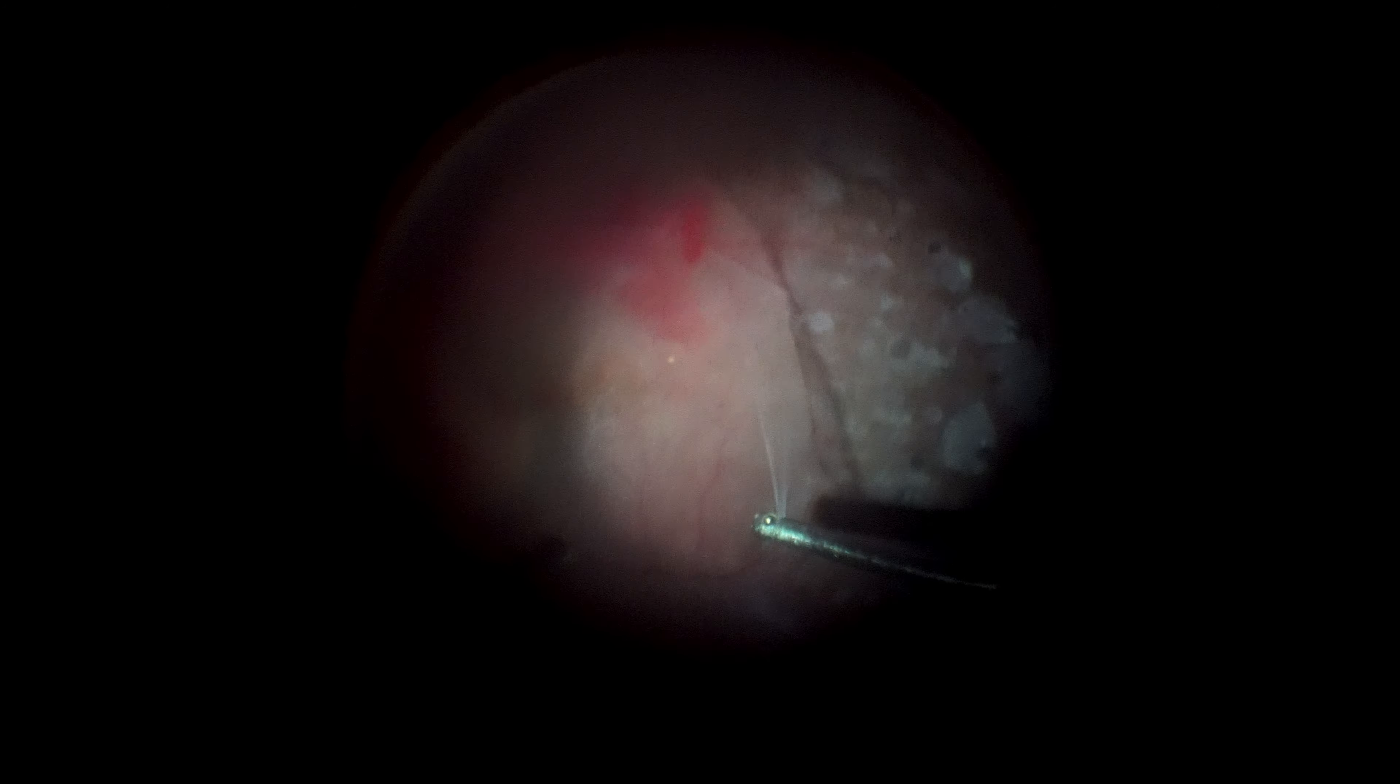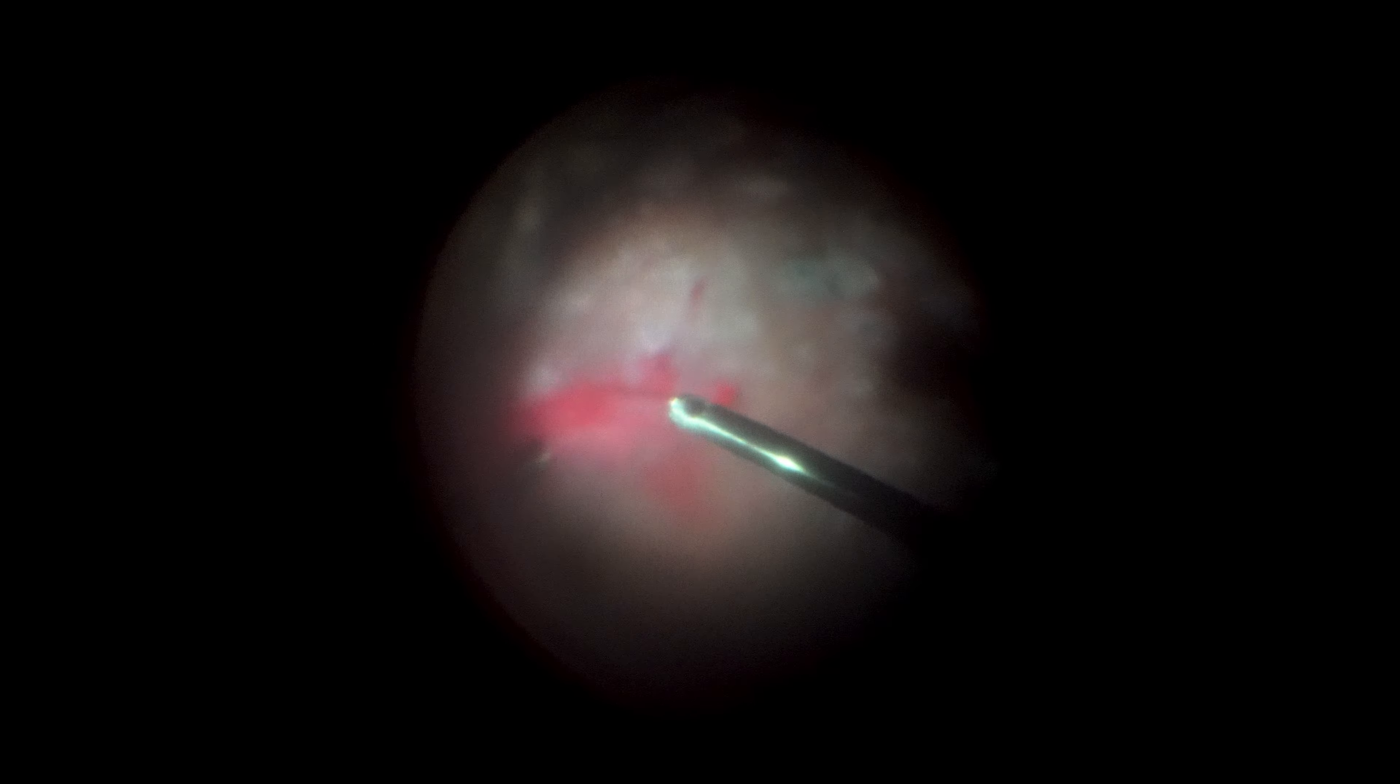Epiretinal tissue and membranes are now visualized. By applying the right and controlled forces, you'll be able to remove them, freeing up the retina and counteracting traction.